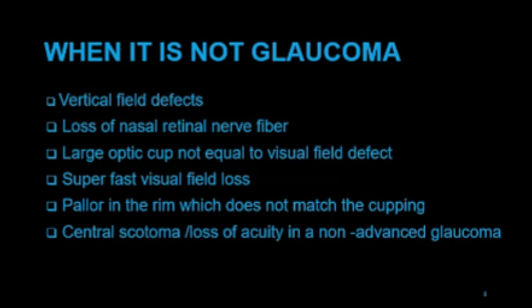So let me begin with when it is not glaucoma. First of all, when you see vertical field defects, we know we are not dealing with glaucoma, because glaucoma obeys the horizontal rule. So when we see vertical field defects, we know we are not dealing with glaucoma.